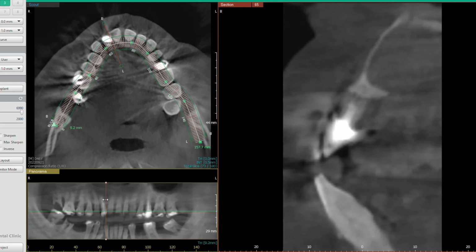So what we were able to do is we actually ended up placing 7 implants on him up top. And what people need to understand is, again, they call it all-on-4 because assuming you have a nice good amount of bone, you get a nice good spread of your implants, all you need is 4 implants. Having more implants offers us greater redundancy, meaning I technically can get away with 4 implants for a table, but if I have 8 legs on a square table, then maybe I have a little bit of redundancy that if I kick out a leg, I'm still good to go.